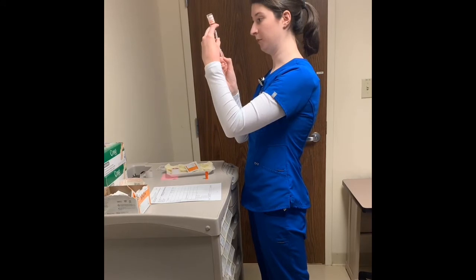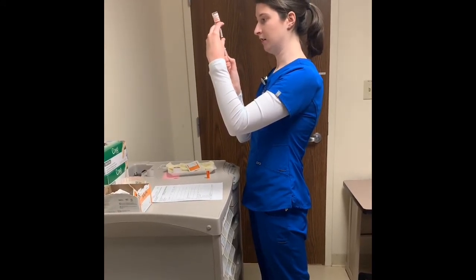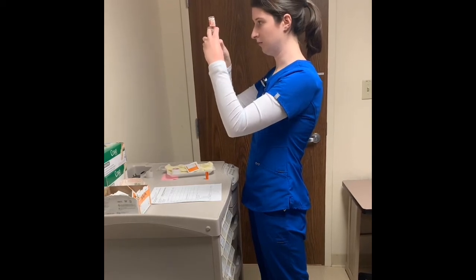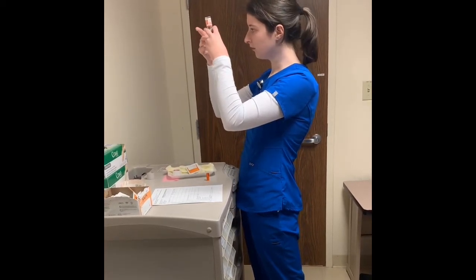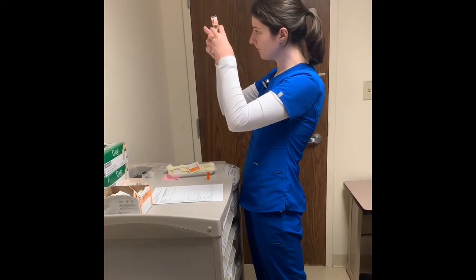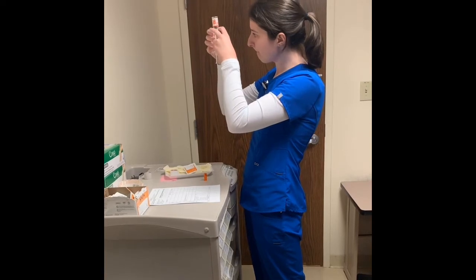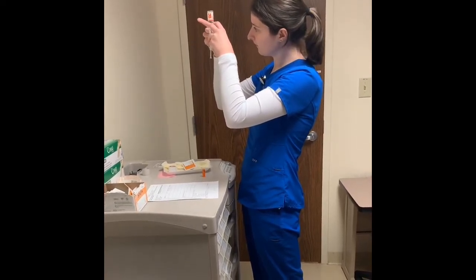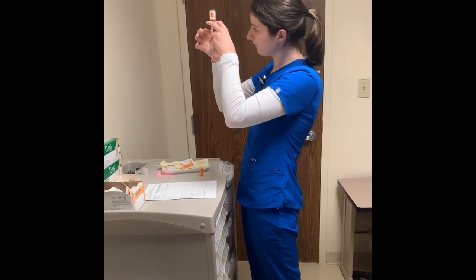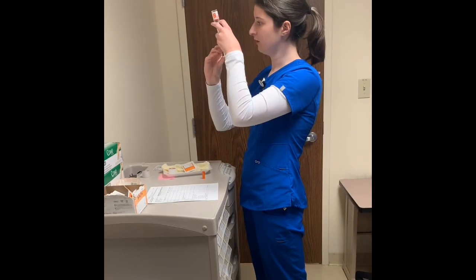I'm going to draw a little bit more because there are air bubbles present, to remove the bubbles. Okay, all of the bubbles have been removed.